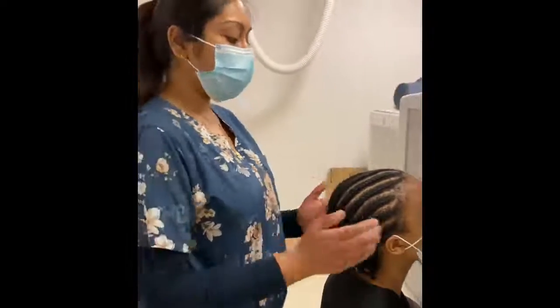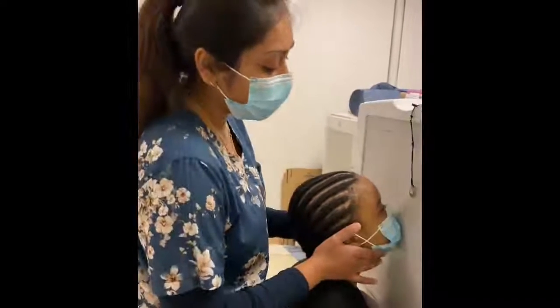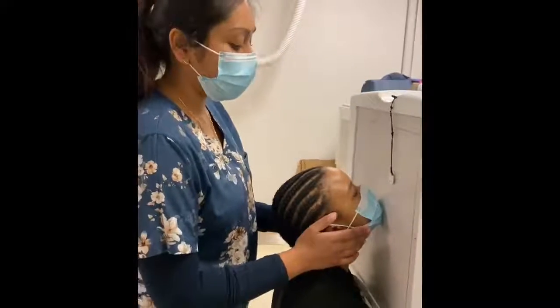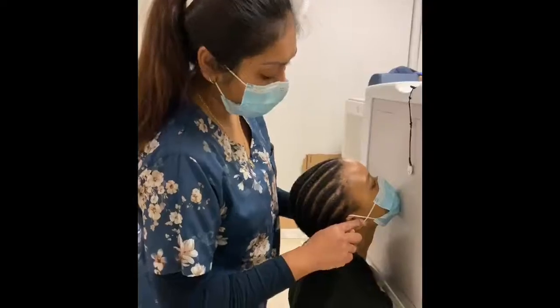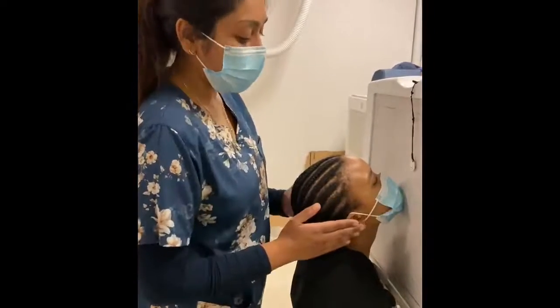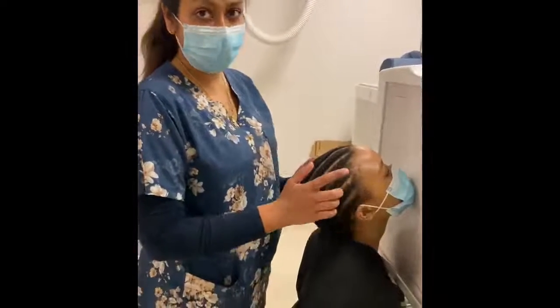From this position, we need to angle or extend the patient's head so that the mental meatus line is perpendicular to your image receptor. Now remember, this is your line from the chin to your meatus. So that line needs to be perpendicular to your image receptor. This actually allows for the OML to be at a 37-degree angle.